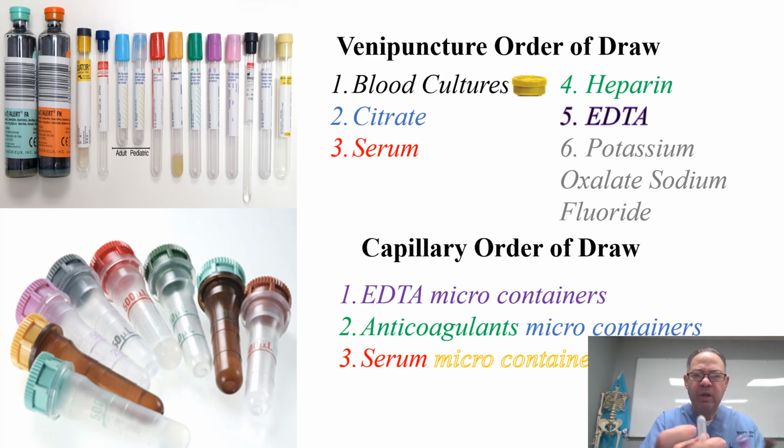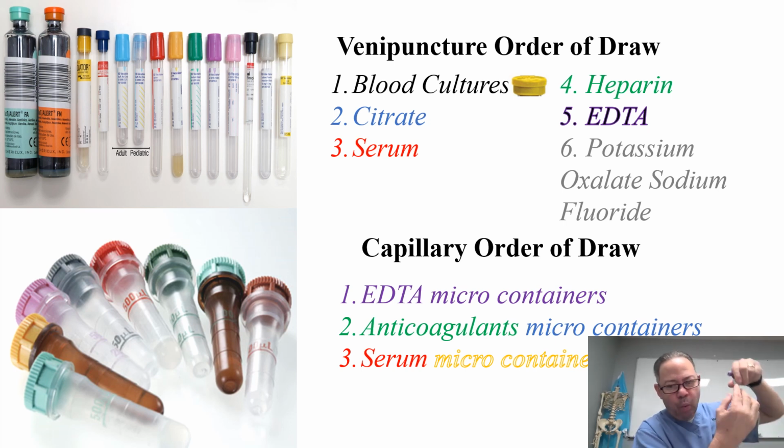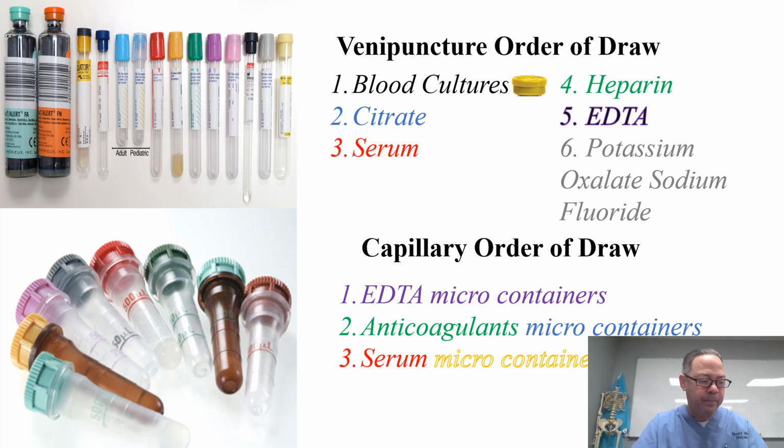And why is that? Well, if you see here, I don't know if you could see here, inside all these tubes there are additives, anticoagulants, that are either inside the walls of the tube, or in powder, or in liquid. So, estos tubos que les estoy enseñando, no es que tienen una tapita bonita para diferenciar una del otro, no tan solo, sino que adentro tienen aditivos y anticoagulantes y agentes antiglicolíticos que paran la glicólisis, que evitan que el azúcar se queme, se pierda.